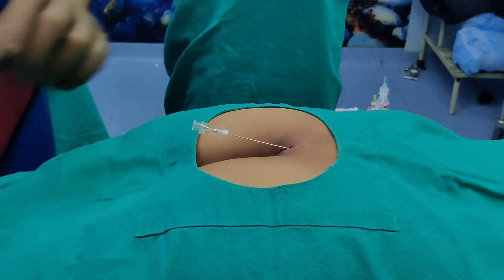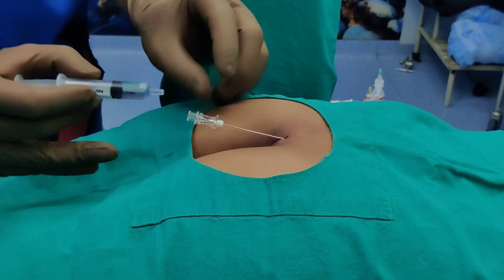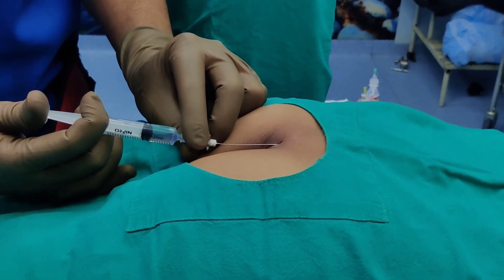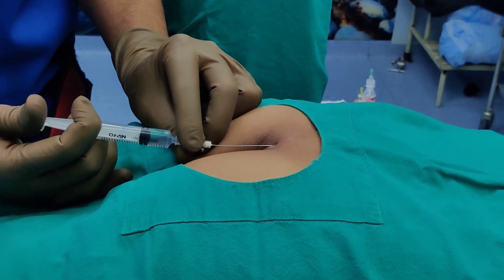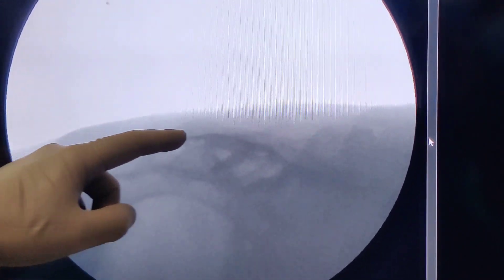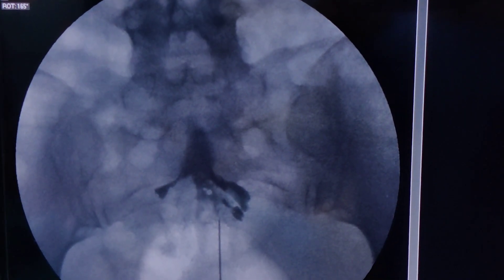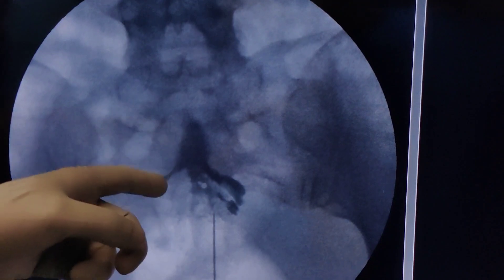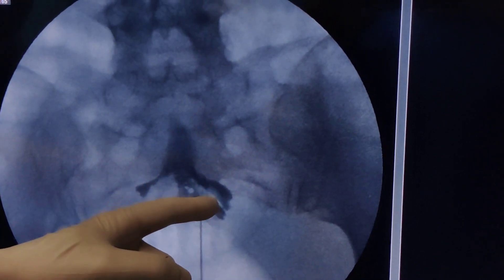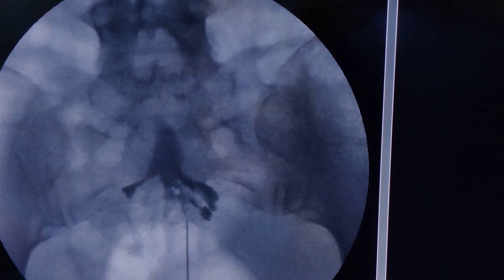The next step is to inject some Omnipaque contrast dye and check under the C-arm to confirm you are in the right space. I inject just a few milliliters and take an image. You can see the needle is parallel and the dye is nicely flowing in the epidural space, following the nerve roots. On the AP view you can clearly see the dye is in the right space and spreading to each side. If more dye were injected you would see the typical Christmas tree pattern on the AP view.